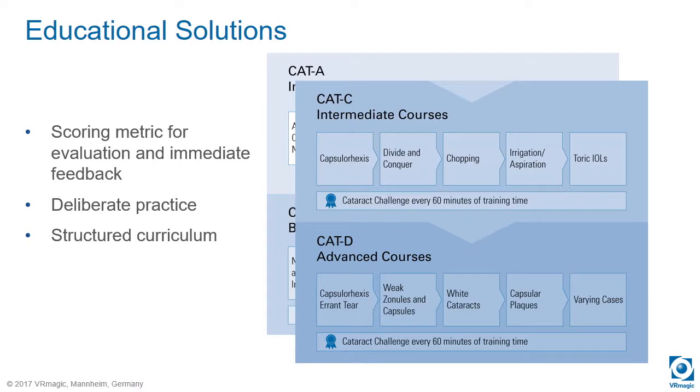We also have what we call cataract challenges. In the cataract case, these are exams that you have to do. They model a real surgery that you have to do in a certain time, and then you get a mark for what you are doing, and your teacher knows where you are standing in your education.